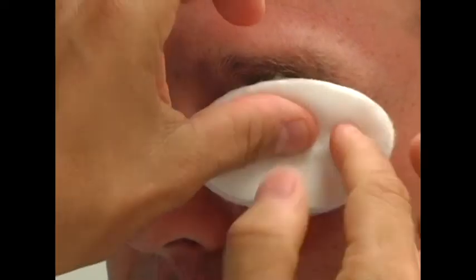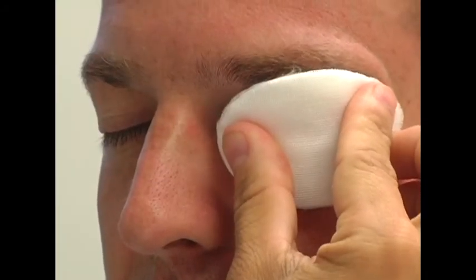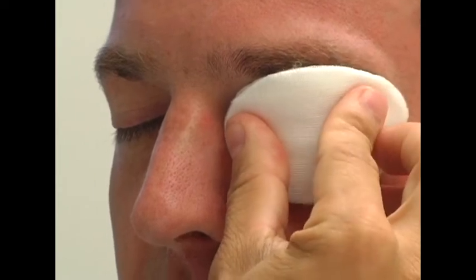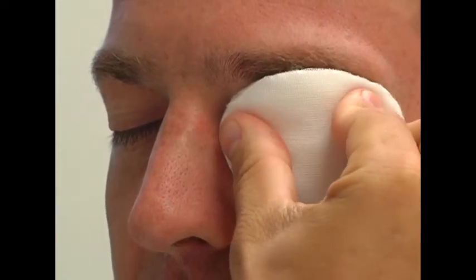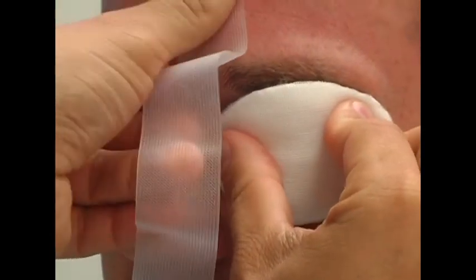Then take another eye patch, do not fold it in half, and place it over the first patch. Very deep-set eyes may require a third patch. Keep holding firmly but gently. Then tape the patch in place.